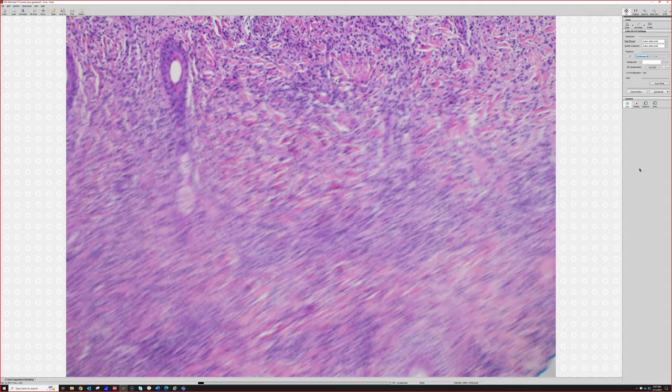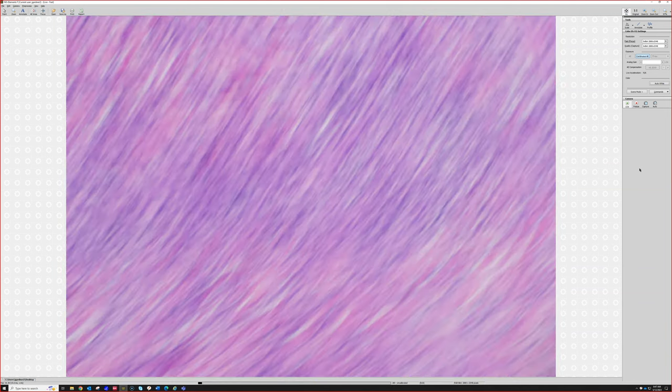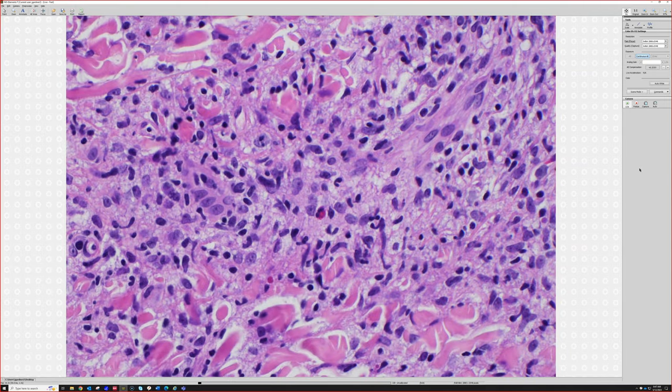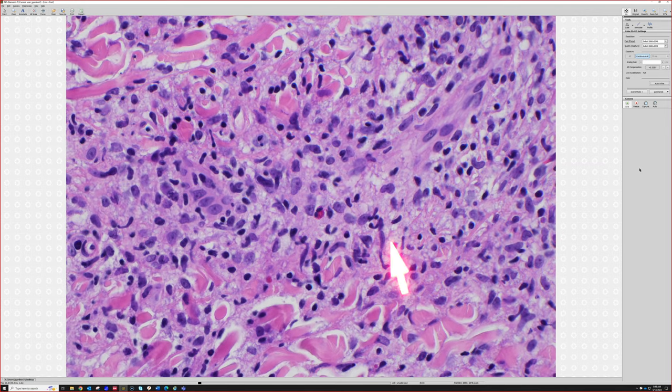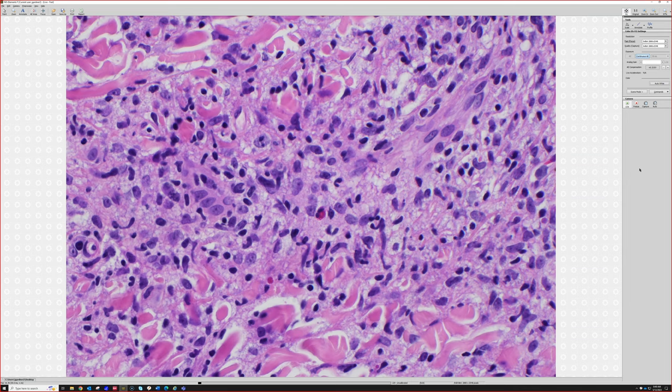And I think about histiocytes especially because I see a sheet-like proliferation filling the dermis, and there's a lot of pale areas that are gray or pink, which means there's a lot of cytoplasm, and histiocytes tend to have a lot of cytoplasm. So right away, when I see a sheet with pale gray pink areas in it, I think we probably have a significant population of histiocytes here. This is a mixed population. We have histiocytes, but we also have other cell types too. So most of these pale cells are histiocytes, and if you look around, most of them have kind of a bubbly vacuolated cytoplasm, so kind of xanthomatous foam cells, histiocytes that have a lot of lipid in their cytoplasm.